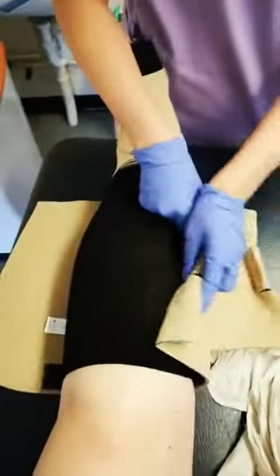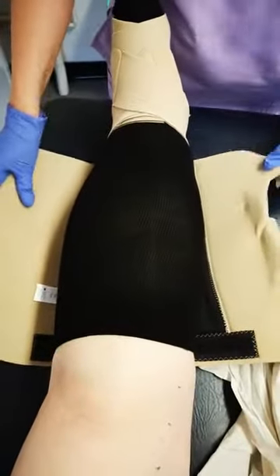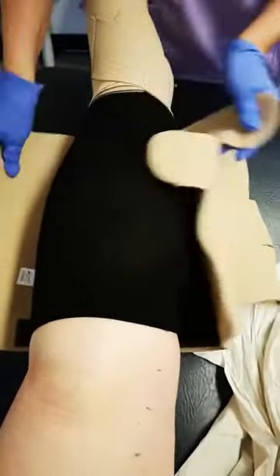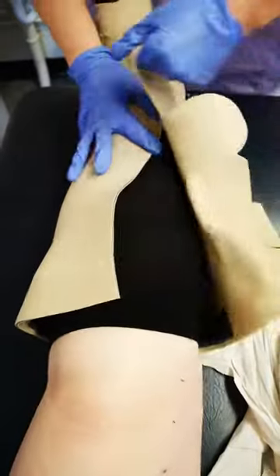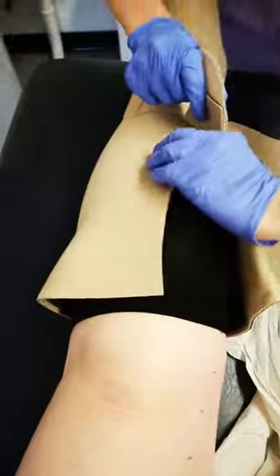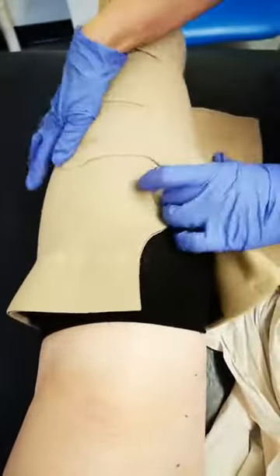There are kind of two layers. I can see the first layer, so we're going to go with the first layer. I'm just going to undo some of these velcro bits. I'm going to really pull here as far as I can and stretch. So I've got the first one on — exactly the same thing, pull in here and pull in there.